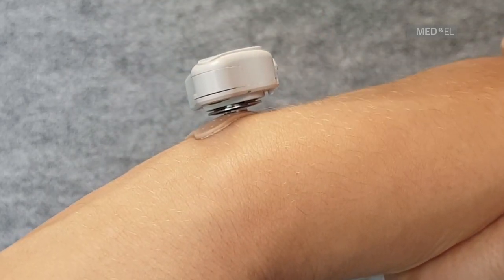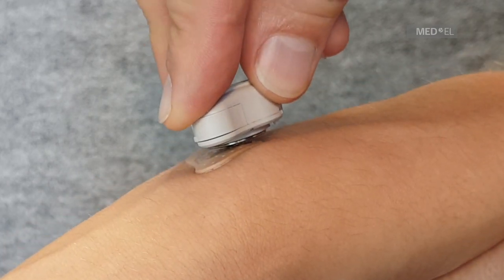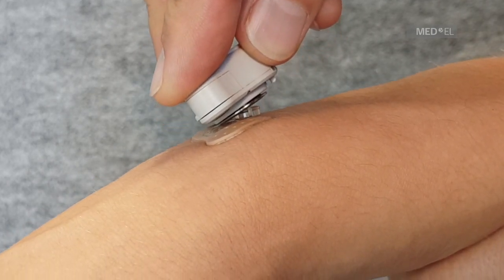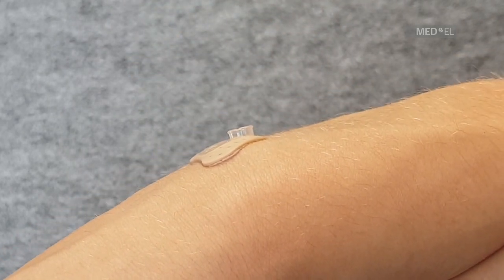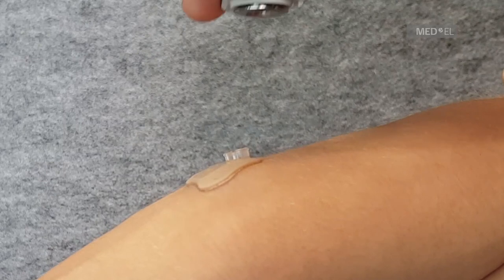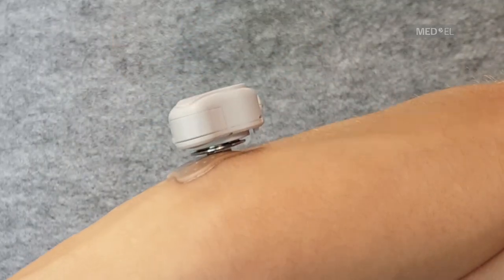To disconnect the audio processor, press down on the long side of the audio processor, then tilt it off the adapter. Remove the audio processor gently and do not pull on the adapter. You can also practice with your eyes closed to get a better feel for the process.